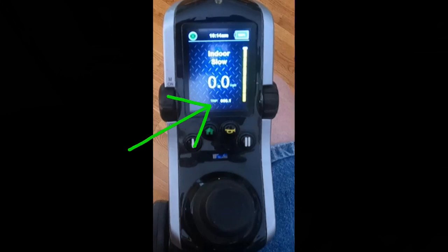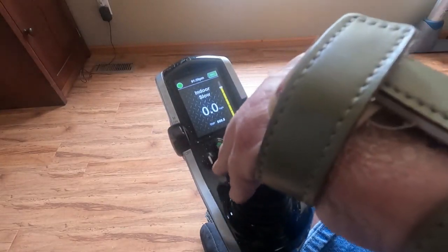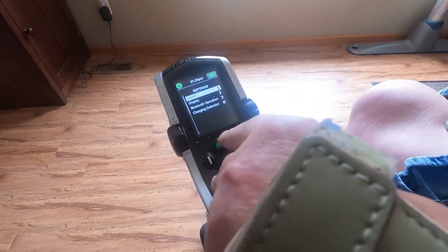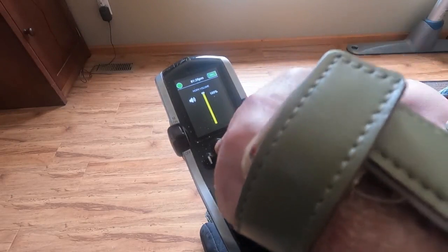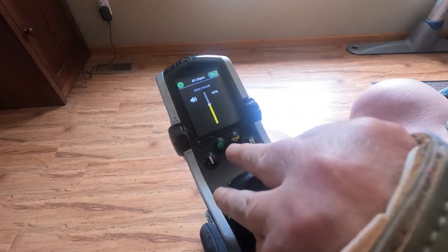Use the same procedure to reset the trip meter to 0. As you probably noticed in one of the previously mentioned screens, well, you probably just noticed the multitude of other selections that can be made when you press that home button followed by landing on the gear symbol. Not only is this where you can adjust the sound level of your horn, you can make changes to the screen display.